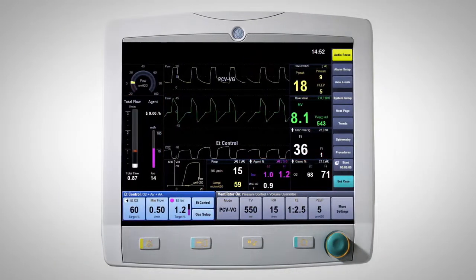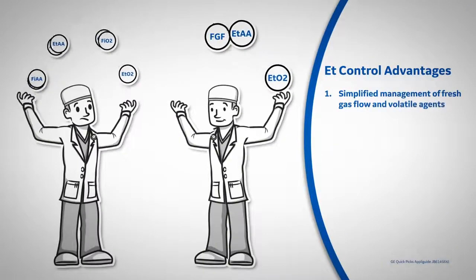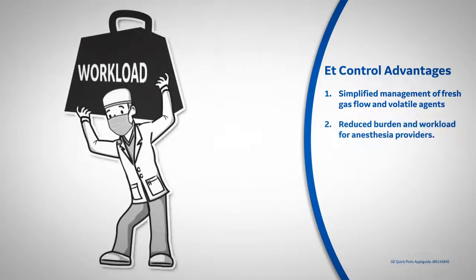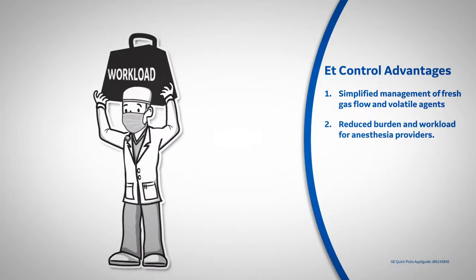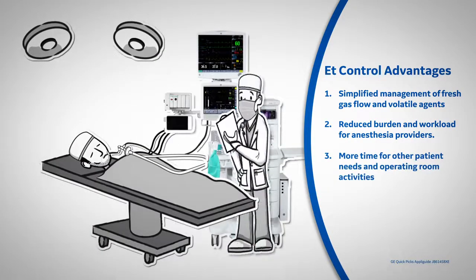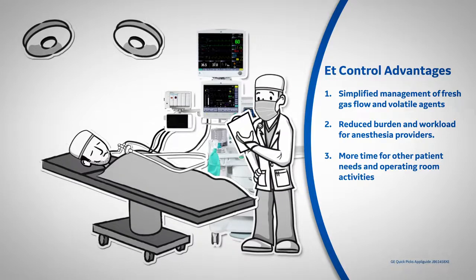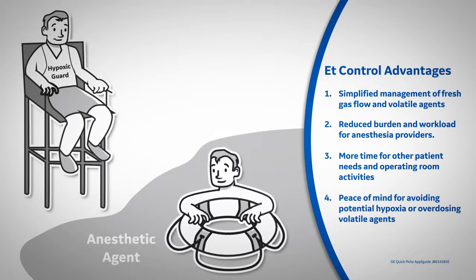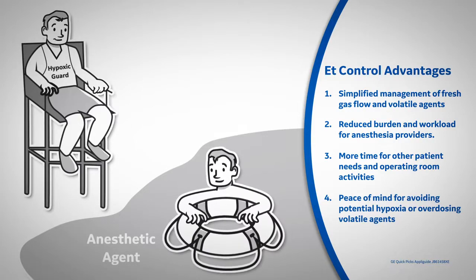There are clear advantages to using end-tidal control: simplified management of fresh gas flow and volatile agents, reduced burden and workload for anesthesia providers. End-tidal control gives you more than a 50% decrease in machine interaction per patient, more time for other patient needs and operating room activities, peace of mind for avoiding potential hypoxia or overdosing of volatile agents.